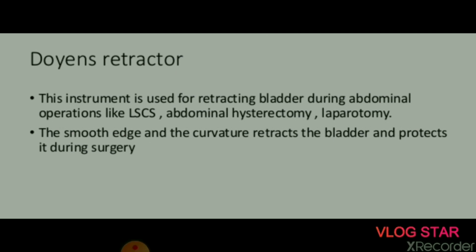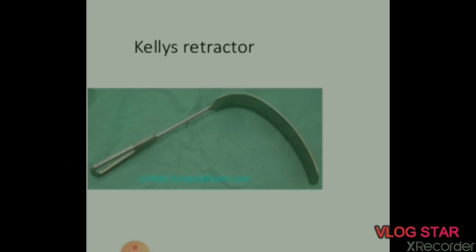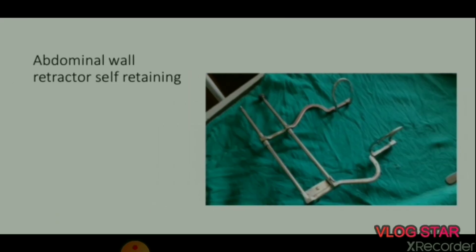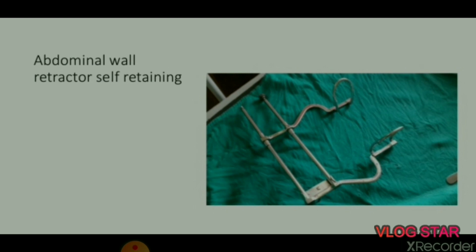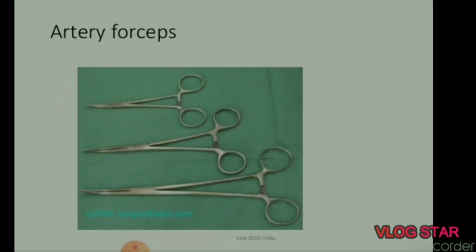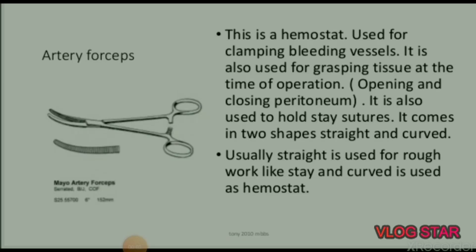Next is Doyen's retractor, known to depress the bladder in cesarean section. This instrument is used for retracting the bladder during abdominal operations like LSCS, abdominal hysterectomy, and laparotomy. The smooth edge and curvature retracts the bladder and protects it during surgery. Next is Kelly's retractor, an abdominal wall self-retaining retractor.